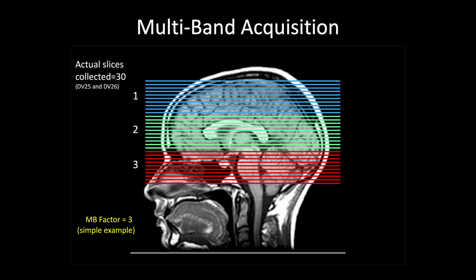But at least up till now, I've been corrected, it's been difficult. If you have participants with a large head, you aren't necessarily able to use the 32 channel coil with them. So my sample tends to be adolescents, it's far less of a problem, but in other studies we've run into this with adult samples.